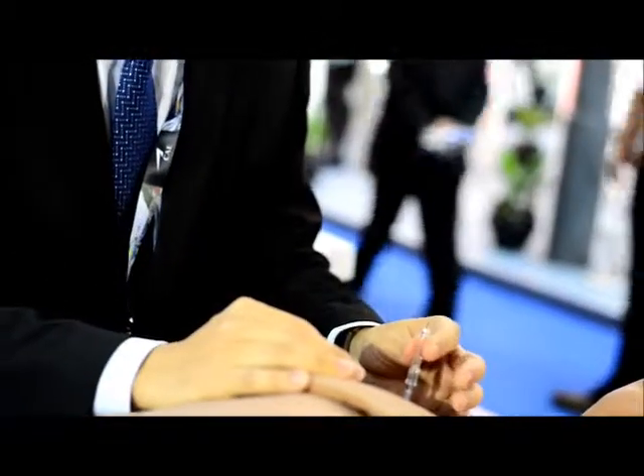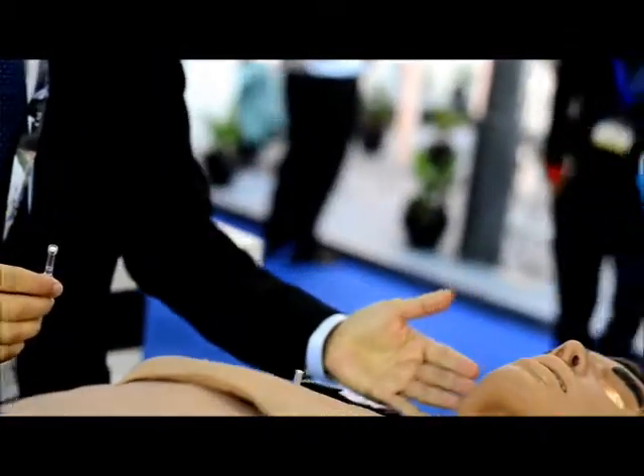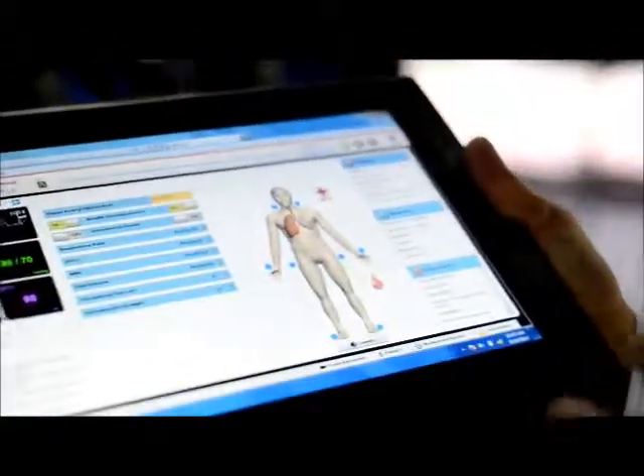Once I pull out the cap you can hear a hissing sound. This mannequin will actually respond to what you did. This procedure is to relieve tension on the right side of the lungs. And again, if the medics are doing it correctly, there will be feedback given to the instructor telling them that they have actually done the procedure well.